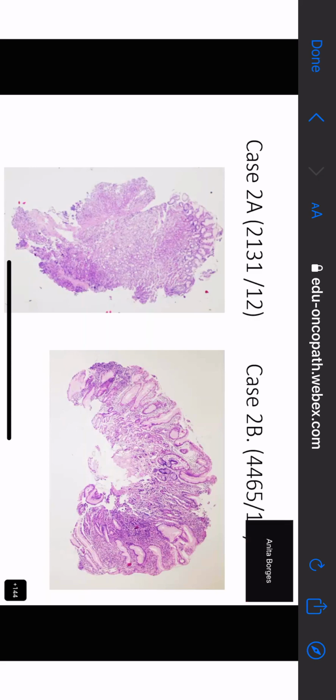All right. Vimy, are you there? Yes, ma'am. Okay. So now please tell me on the left-hand side, which part of the gastric mucosa is that? This is fundic, ma'am. Fundic means what? Is it the same as body? Is it like the antrum? Is it like the cardia? You don't know, no, ma'am.